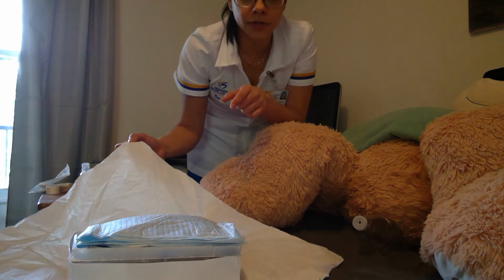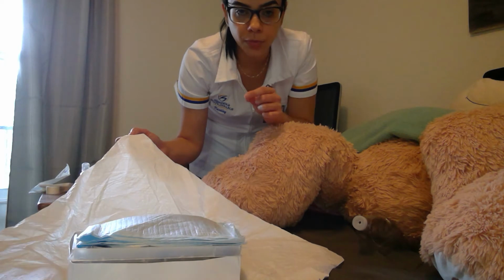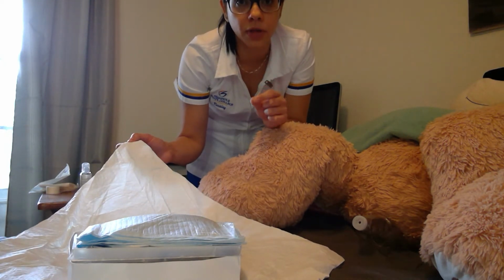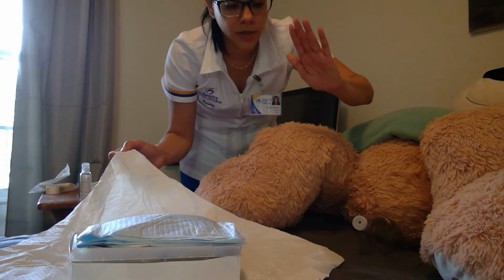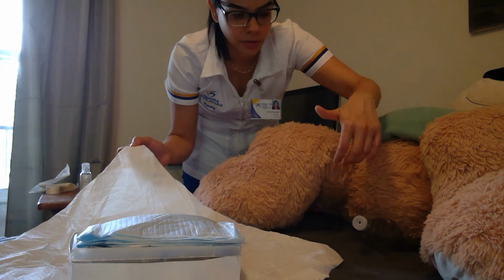And the first thing I'm gonna find in there is the waterproof drape, and it has a shiny part, and that shiny part is the one that we can touch. And then we're gonna put the shiny part touching the bed underneath our patient's vagina.